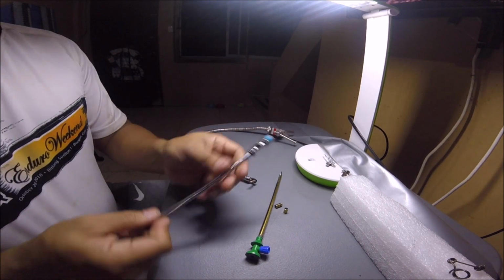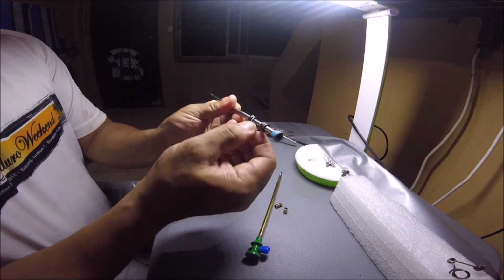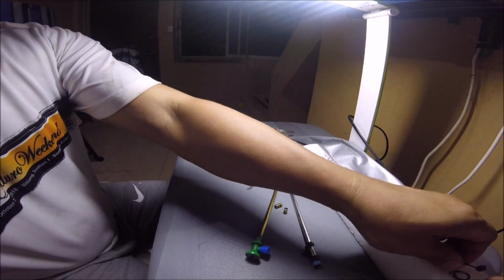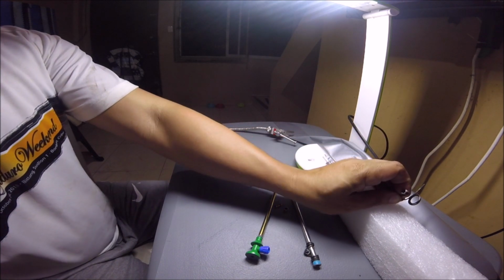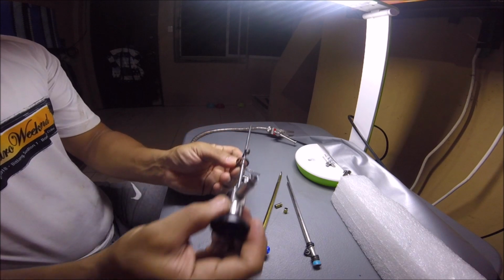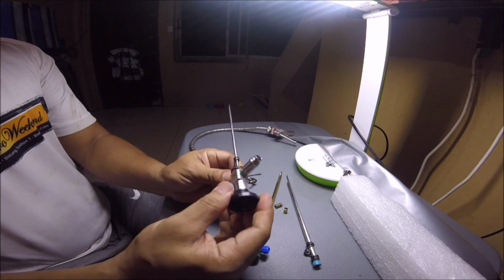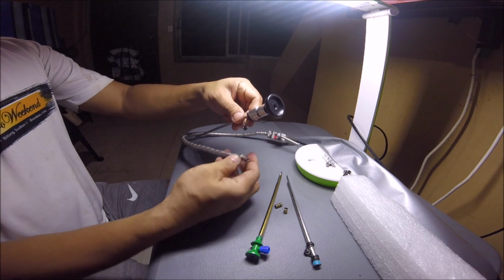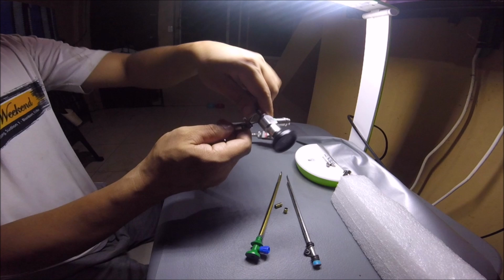Okay, let's review the scopes. This is the old one. I revised the scope holder. Again, this is just spokes of a bicycle. Bicycle scope. Another bicycle scope project. This directly holds the scope. So if I wanted to just use the scope without using the tube, I can just swing it in there, lock it in, and it can hold. Now this basically fits the Layla.